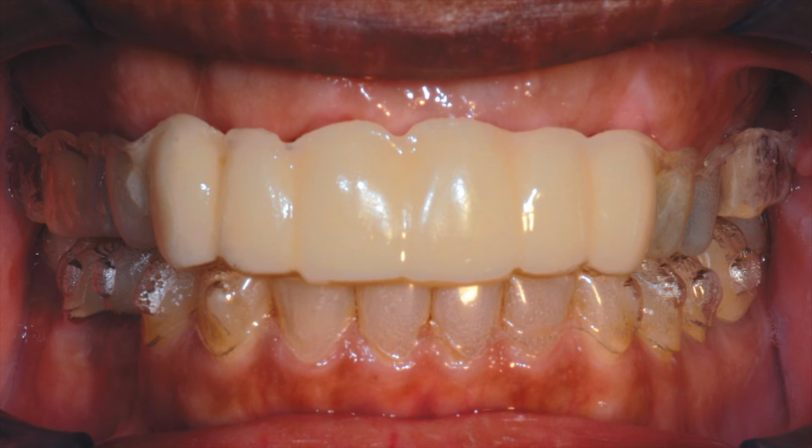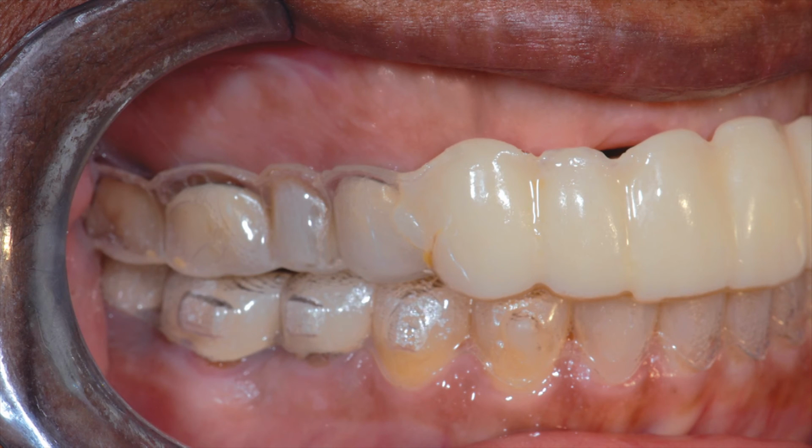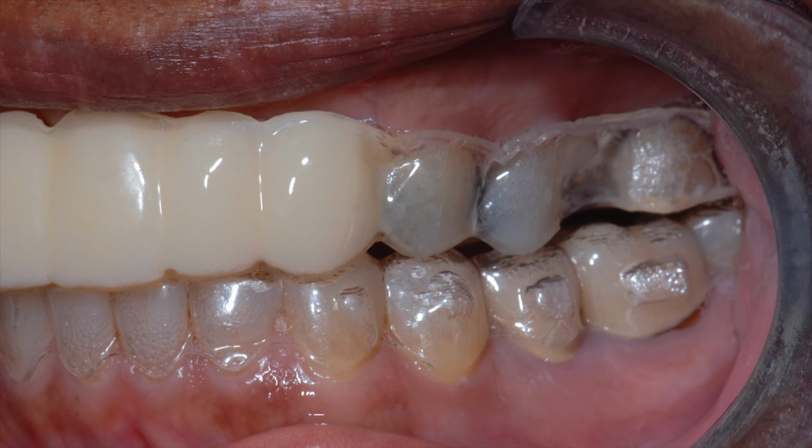After extracting the patient's remaining maxillary canine and central incisor, the maxillary thermoplastic Pontic appliance was seated, as well as the first in a series of mandibular Invisalign aligners. This allowed healing of the extraction sites and execution of the tooth movement treatment plan to occur simultaneously. The aligner attachments were closely observed and monitored in visits to ensure proper seating of the aligner attachment reservoir.